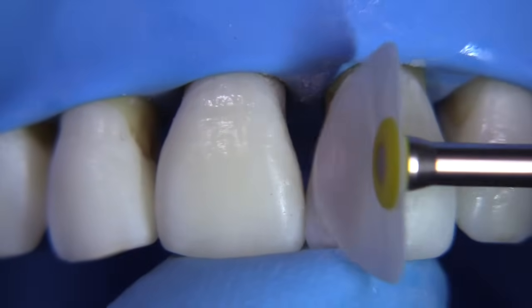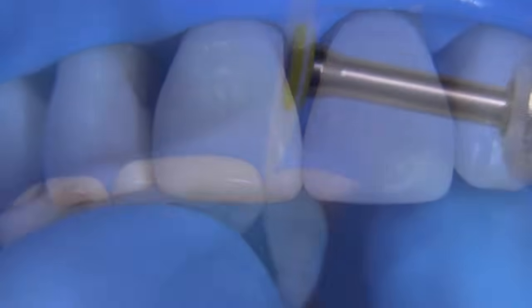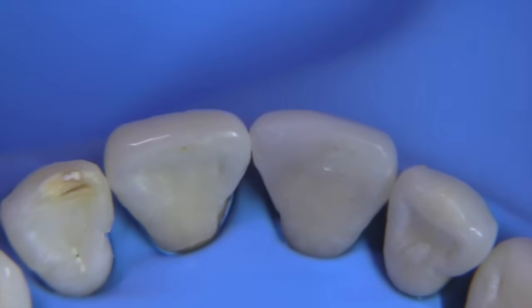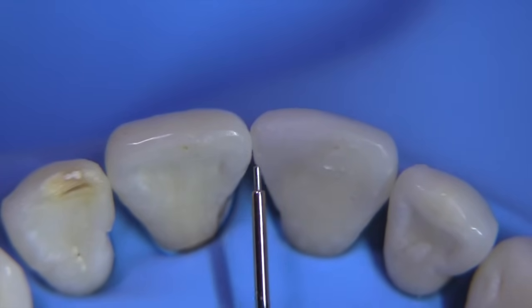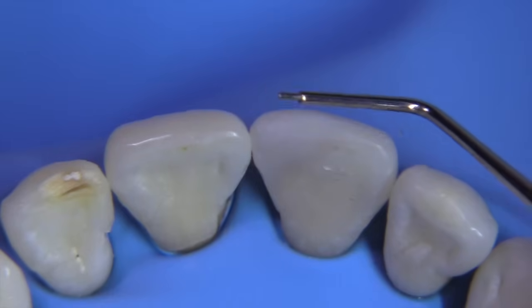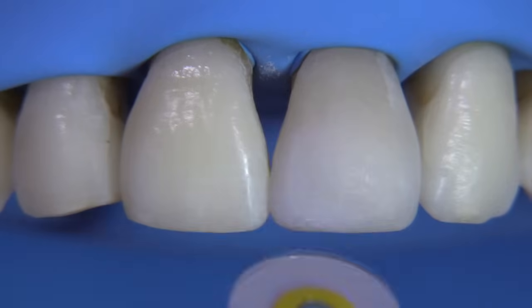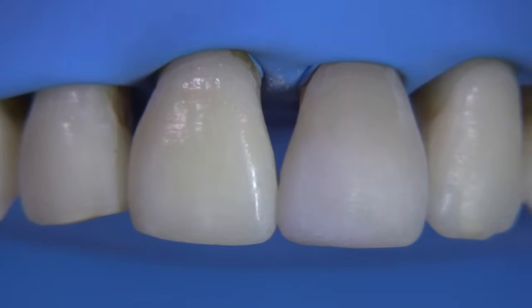Even though the shade is not ideal, the contours are looking a lot better. When the contours look good and you get the texture a little bit improved, you can usually get away with a simple composite sequence like this. There's a little over-contour on the mesial we need to remove, and a little work to do on that facial embrasure over-contour. While the disc is fine, you can run it across the surface lightly, skimming across and creating the contour changes you need.